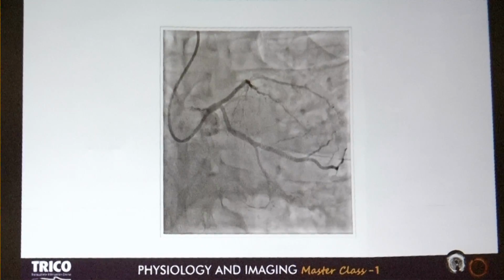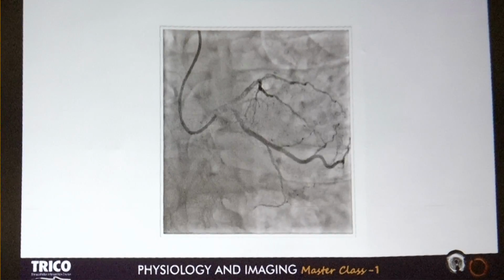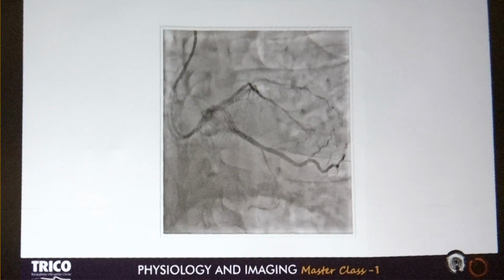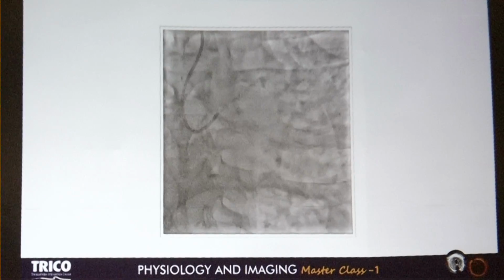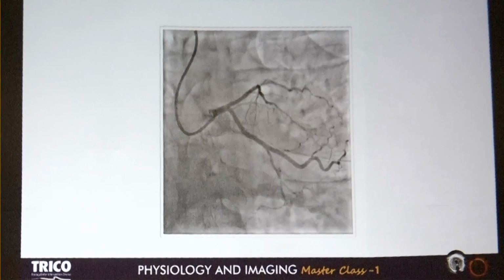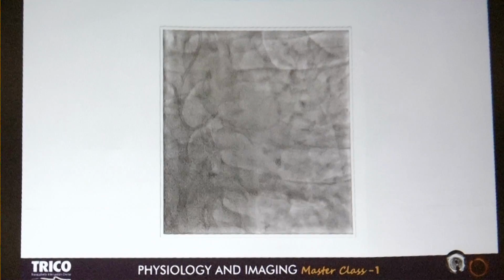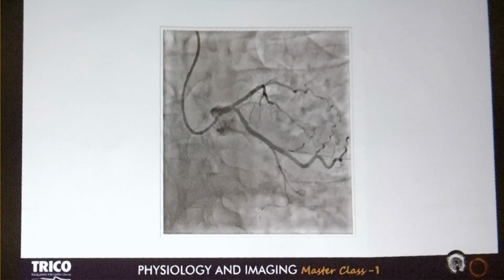So what is the normal instinct? Here we evaluated using OCT. It looked good. But still we have a tendency to do something.